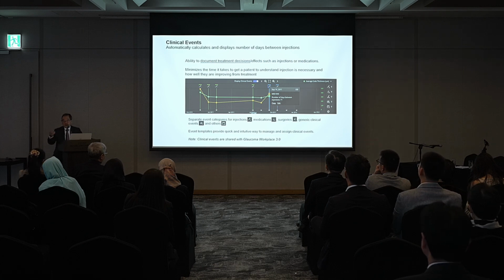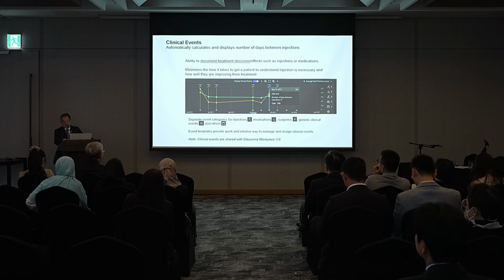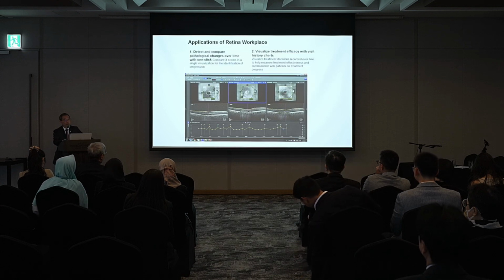One of the feedback we've given Zeiss is we should also have it in weeks. After all, most of our treatments are targeted at how many week intervals once you've gone beyond the loading phase. Here, currently the software only calculates the number of days between intervening treatments. So there are many applications.